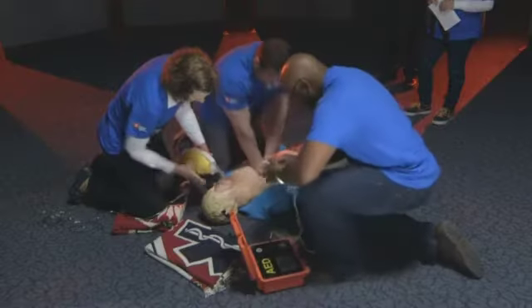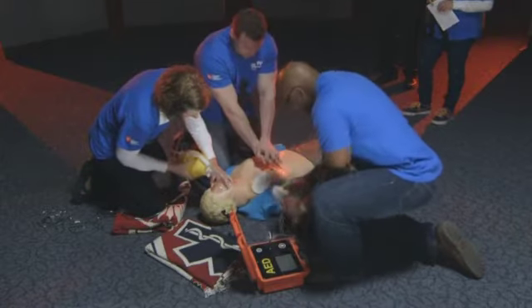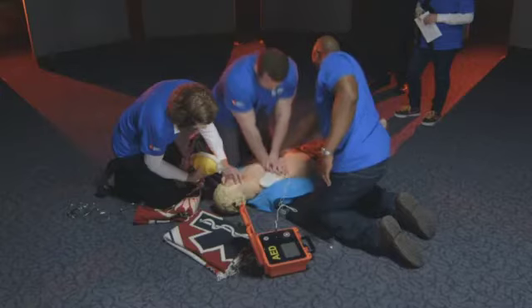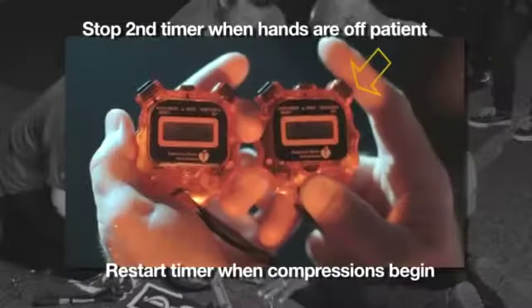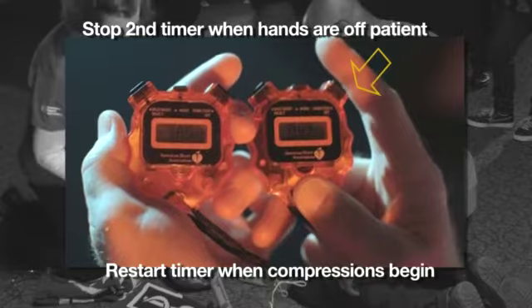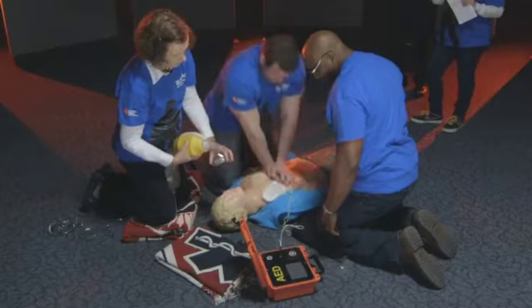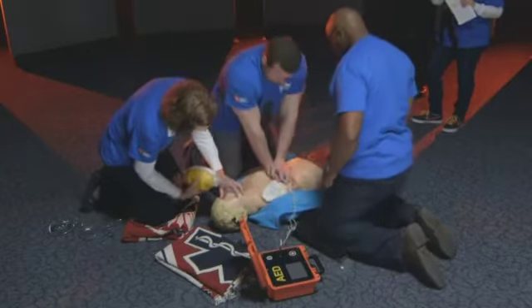Apply pads to patient's bare chest. Plug in pads connector next to flashing light. Analyzing heart rhythm — stay clear of patient, do not touch the patient. Shock advised. Charging. Stay clear of patient. Deliver shock now. Press the orange button now. Shocking three, two, one — clear. Shock delivered. Begin CPR.